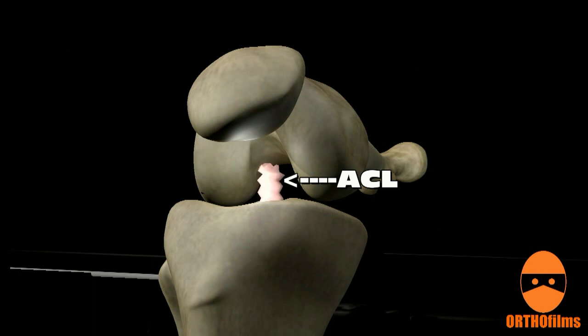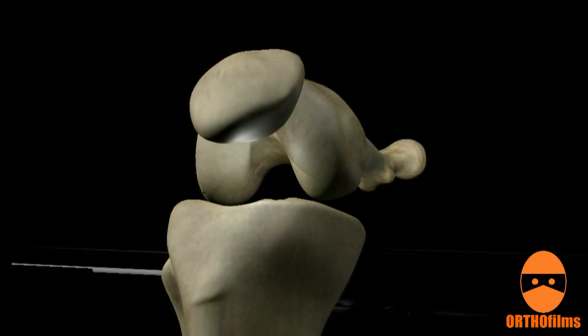The ACL tear is confirmed. The stumps of torn ligament that remain are debrided and removed.